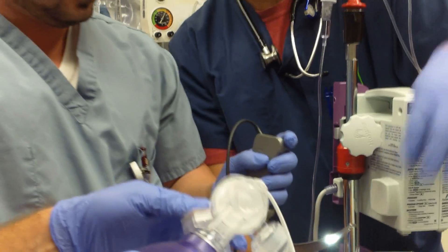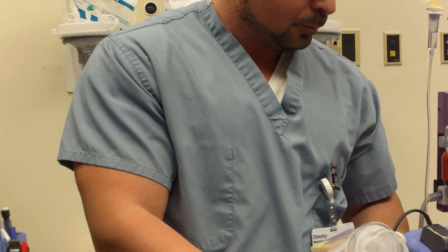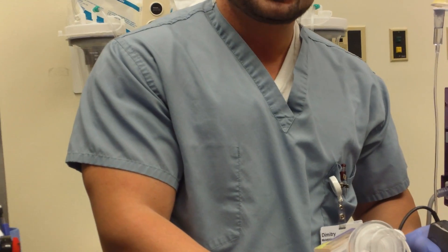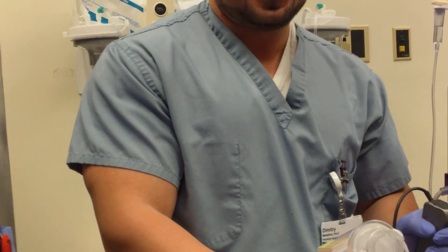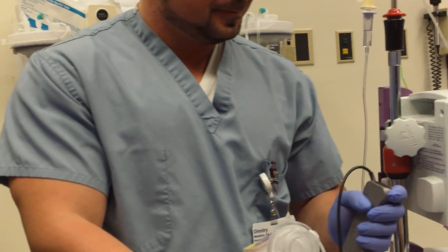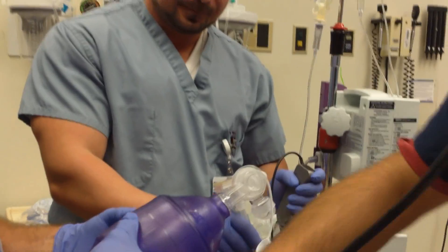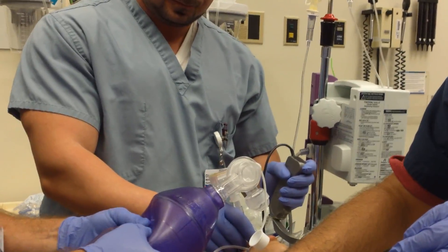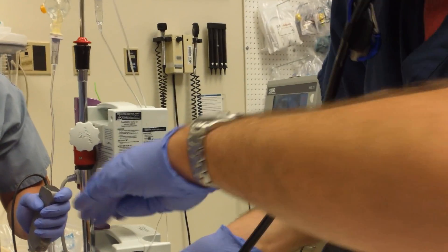Watch the tube. Hold on to that for your life. Now Demetri, is that your first one? Second one — with the C-Mac. See how junky she is? Sounds really junky. She's got no gastric sounds; got good breath sounds. Equal? Yes, they are equal.